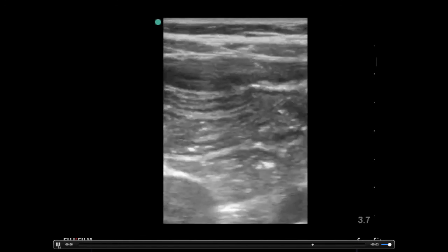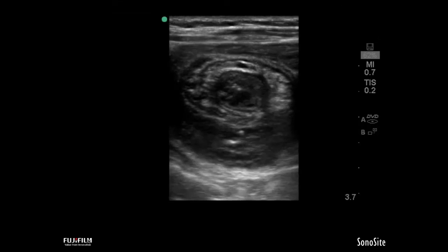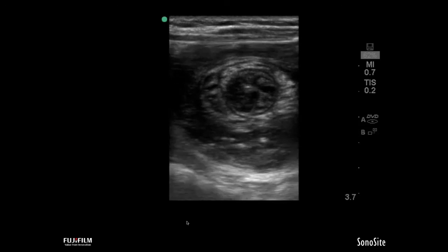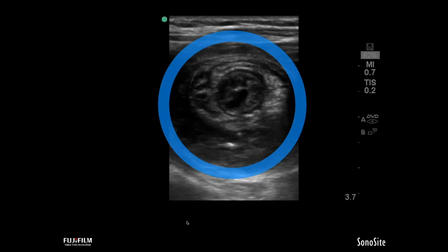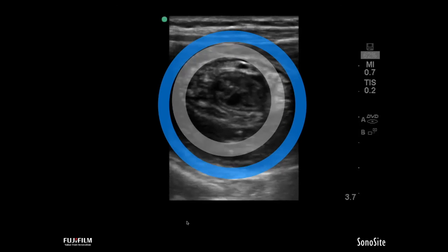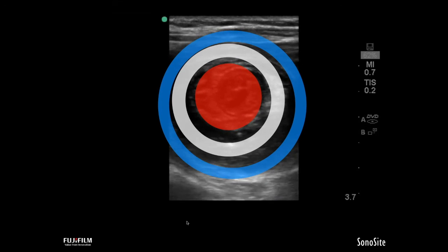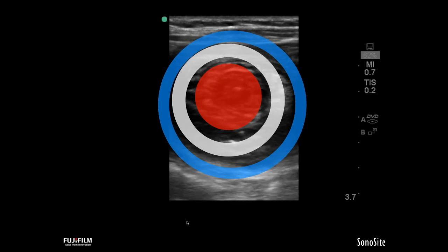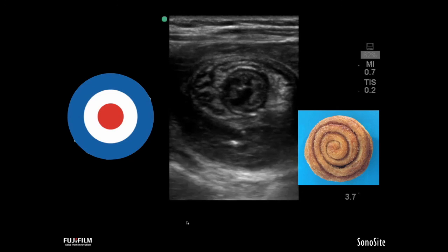In contrast, if you pick someone who has intussusception, what we see is a targetoid or circular appearance as one piece of bowel pushes into the other section. This has that target or circular appearance with an outer wall, middle, and inner wall. It's called the target sign. I think about it more like a cinnamon roll sign because I can see that spin and movement through it.